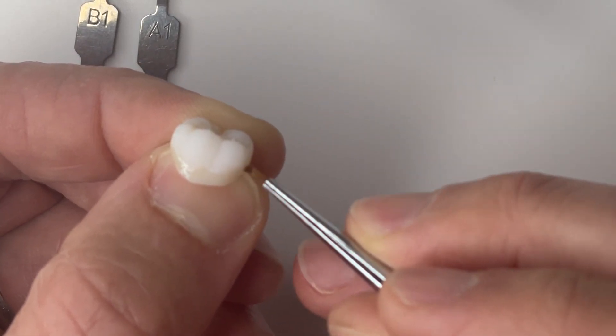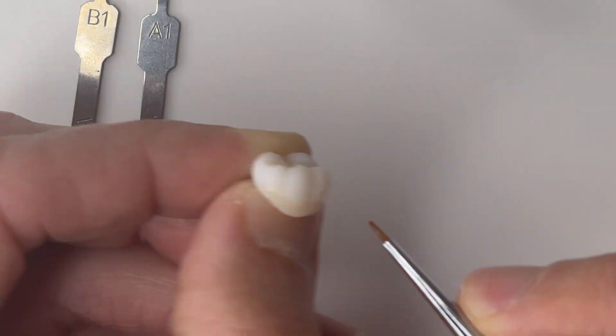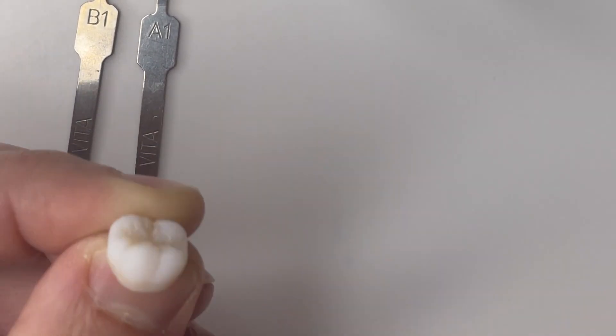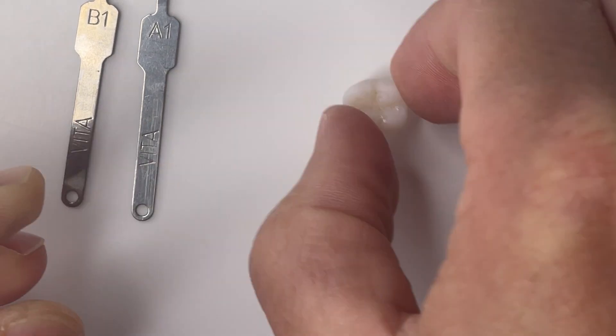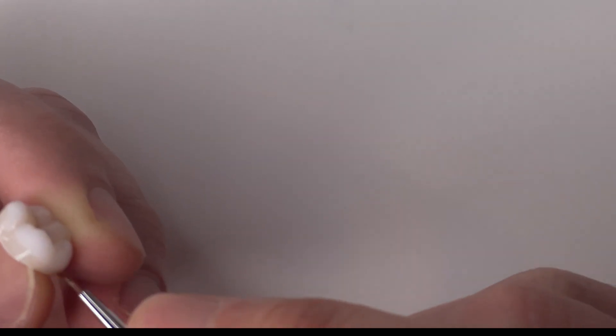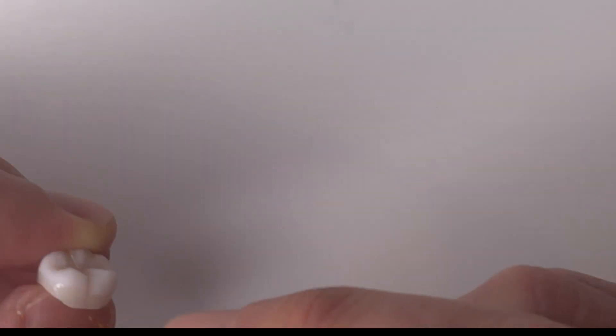Using a really fine tip brush, I'm adding this first layer. Once I get this first layer added, I'm going to polymerize just this first layer, and then continue to add and expand the area I'm working. In this case I'm adding more to that cervical third but also moving up more towards the occlusal surface with that stain.